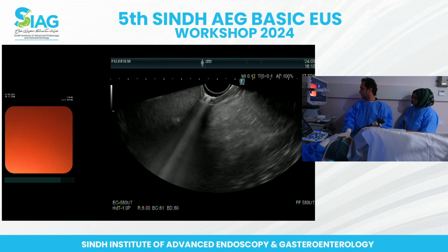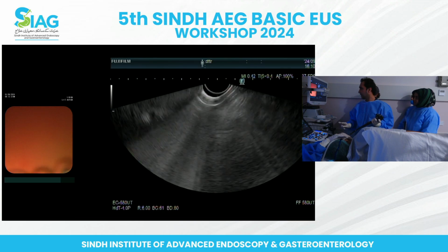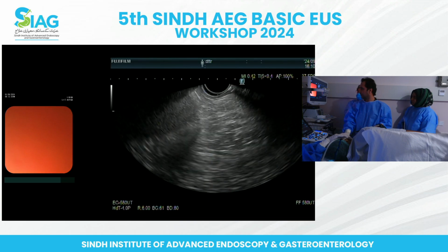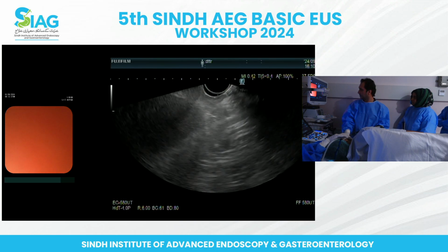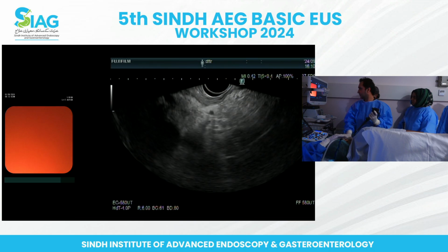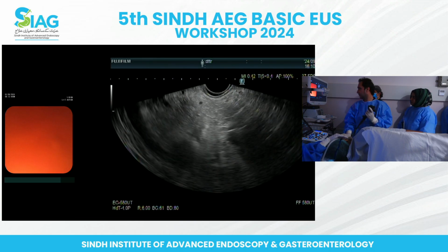So from here, I should go. This is a maximum anti-clockwise. Okay. Fine. So let's see if we can go to the clockwise now. And just follow the bile duct into the mass.